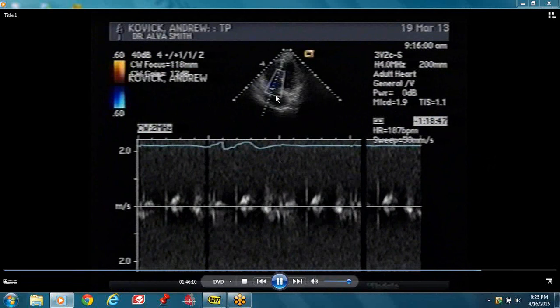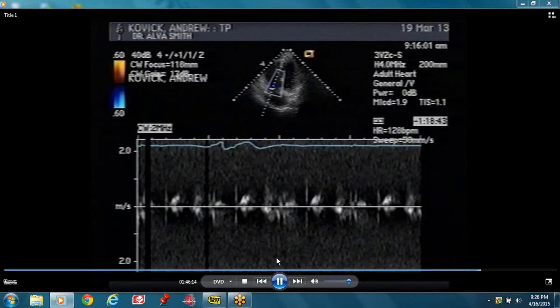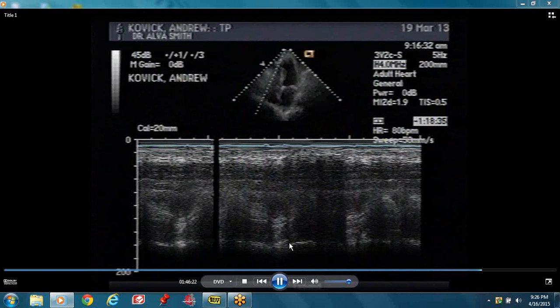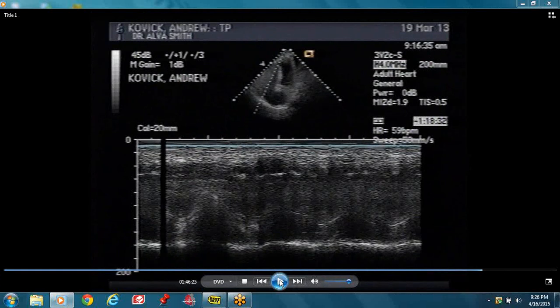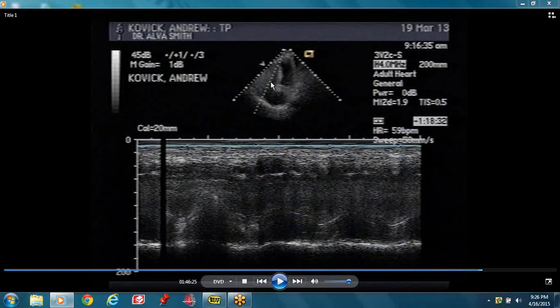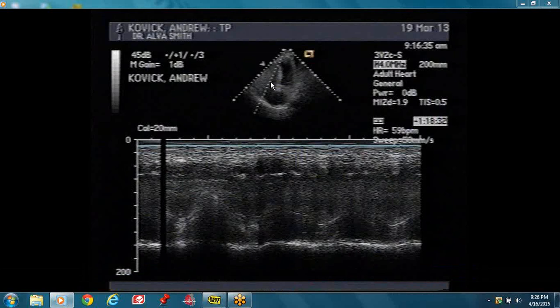You must always evaluate the right side. We talk about TAPSE and we're going to do it in more detail when we do the right side of the heart. She's doing TAPSE — it's one method of assessing right ventricular systolic function. It's an acronym which stands for Tricuspid Annular Plane Systolic Excursion — T-A-P-S-E. You put your cursor at the lateral tricuspid annulus and you're looking to see how much it moves up.